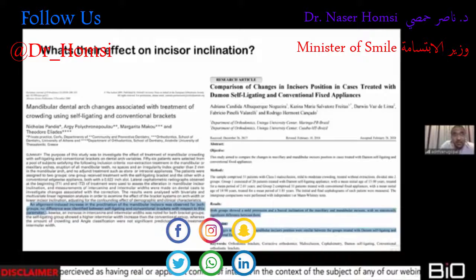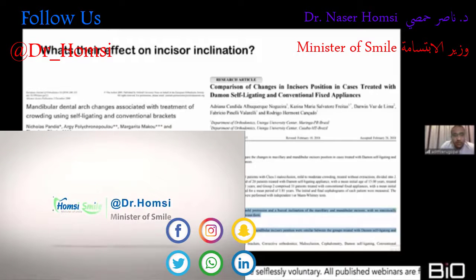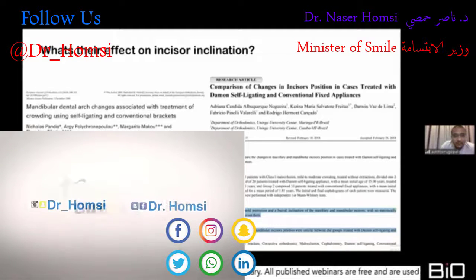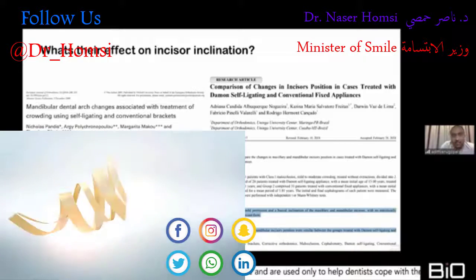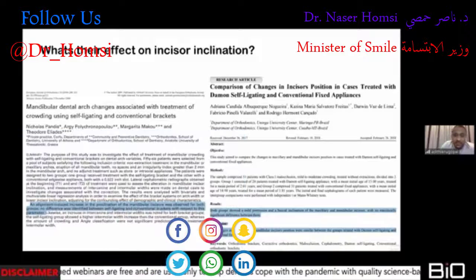definitely yes, because when I use self-ligating brackets, I call the patients every 6 weeks or 7 weeks, and the copper nickel titanium wires, they have really nice resilience, and they're very good wires to initially alleviate crowding. And as Dr. Pao says, you need to leave the wire inside to cook a bit, and once the wire does its job, you can see good results. And because the forces are very low, and I'm going to get to that, I'm not just saying it, there's evidence behind it.